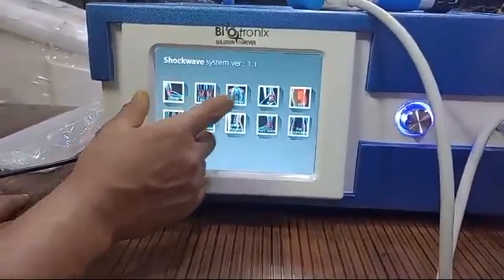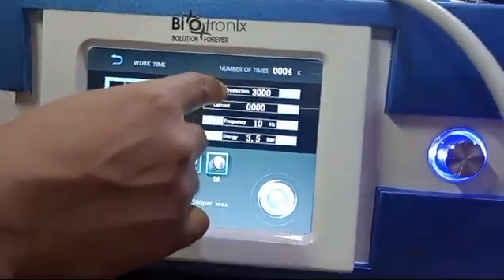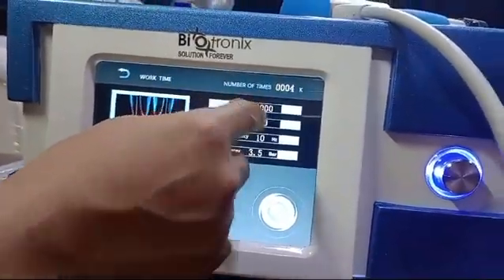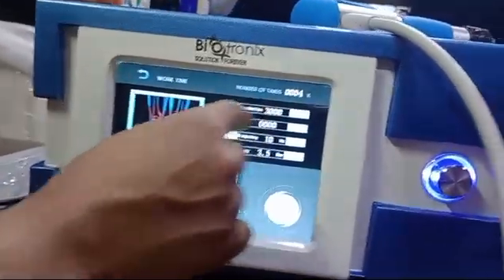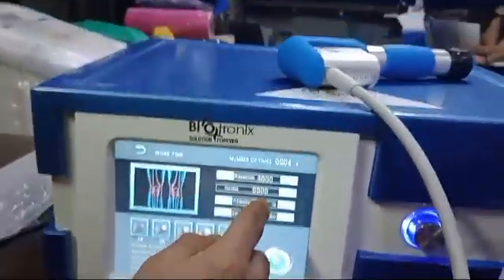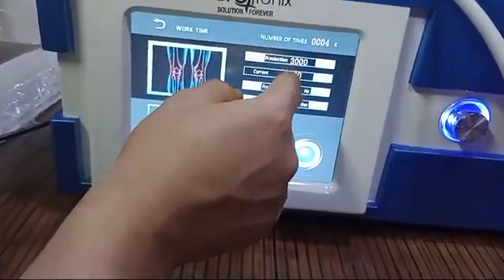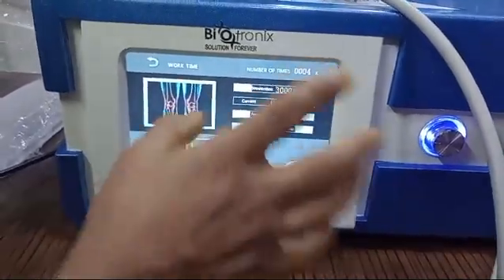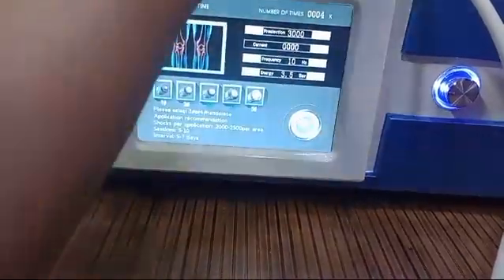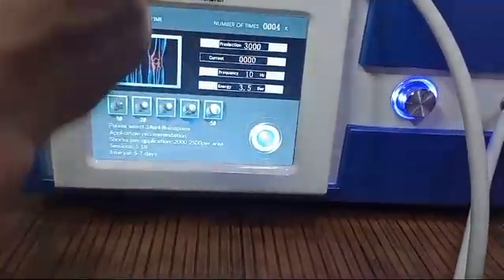Like, I select the knee treatment area. In the knee treatment area, you see the pre-selection is 3000 shots. Currently the counter is 0000 because I haven't used it. When I use it, it will count the shots and keep increasing, and when it reaches 3000, the treatment will be switched off. You can also stop it in between using the switch on the touchscreen or using the switch on the probe. I will show you.